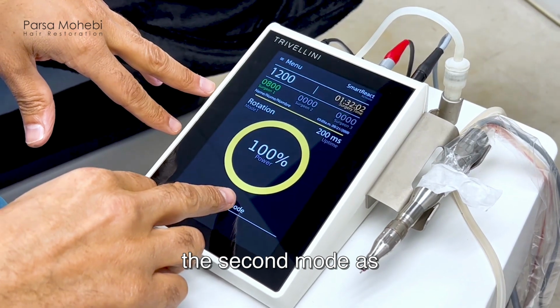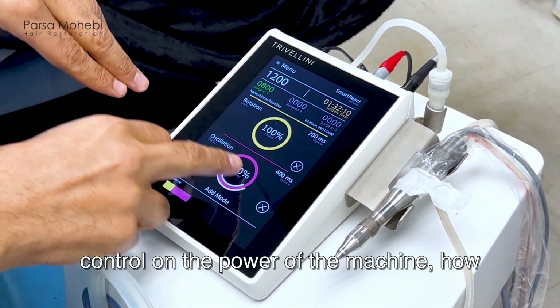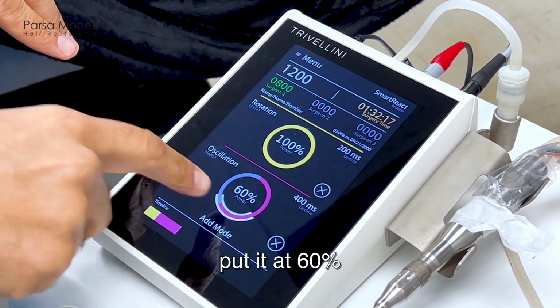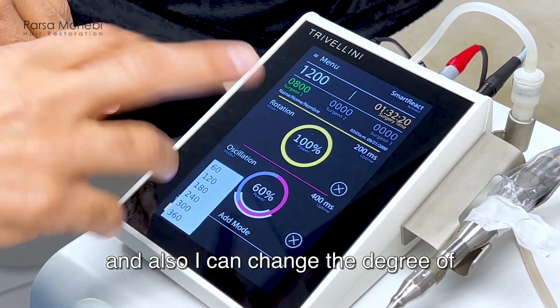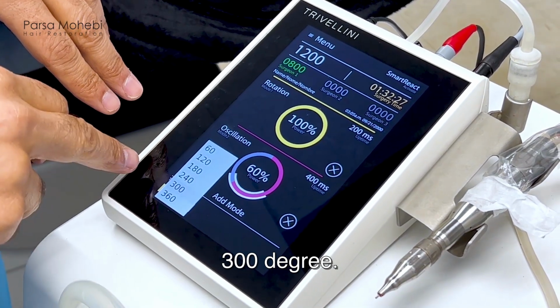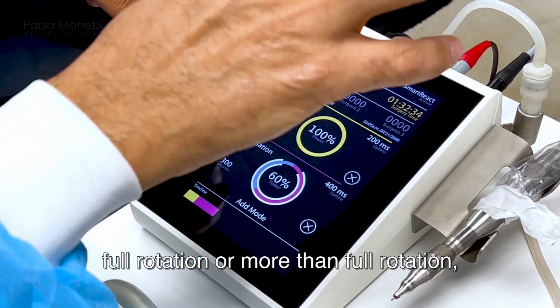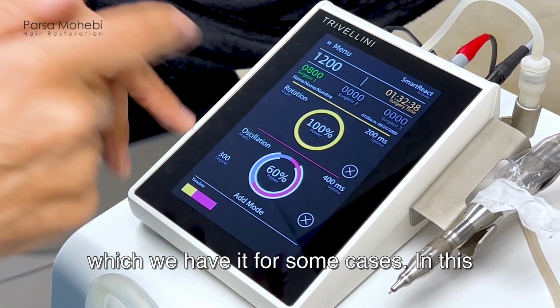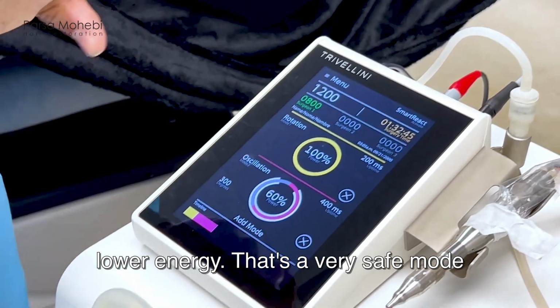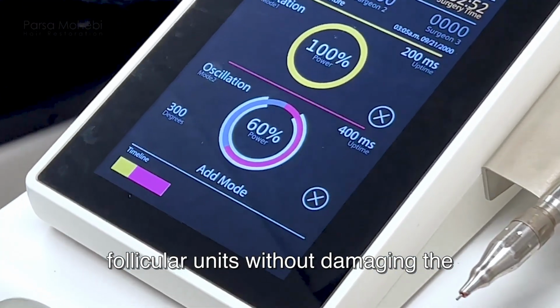We're going to add the second mode as oscillation in this case. So we're adding oscillation. We have control on the power of the machine, and how fast we want the machine to go back and forth with oscillation. In this case, we put it at 60%. And I can also change the degree of rotation, or I'm sorry, oscillation. That oscillation degree, I put it to 300 degrees. So in this case, we're not going with full energy and we're not going with full rotation or more than full rotation, which we have for some cases. In this case, we're going for 300 degrees back and forth with lower energy. That's a very safe mode for the deep layers of the skin and to liberate the grafts, liberate the follicular units without damaging the follicles.